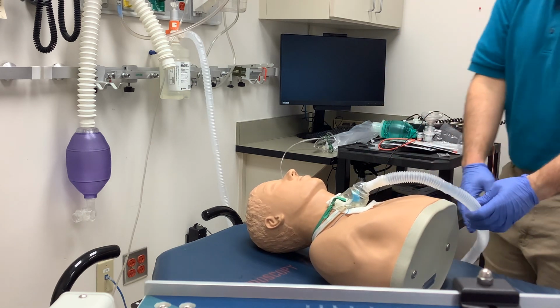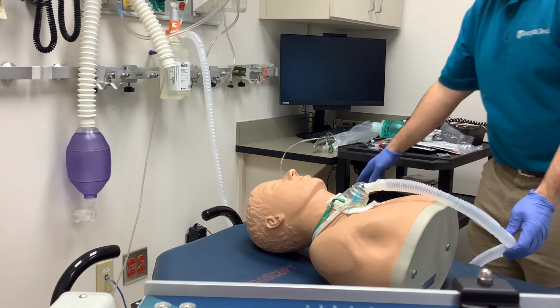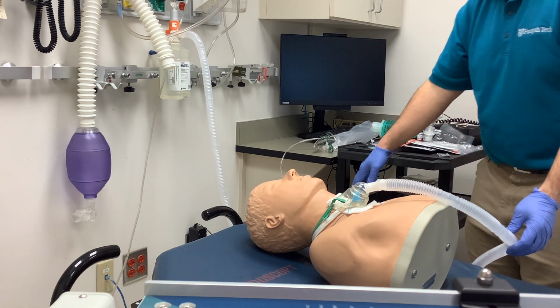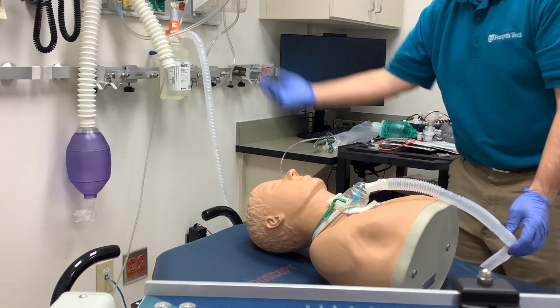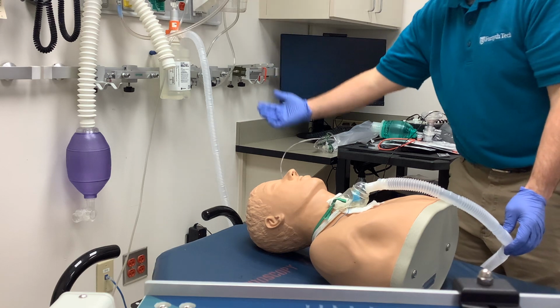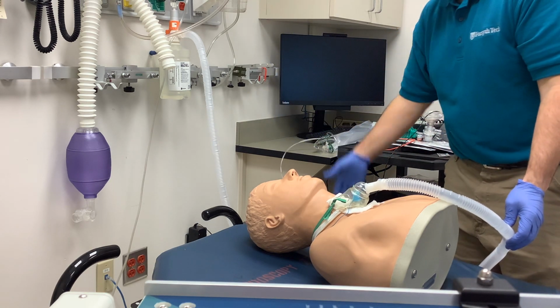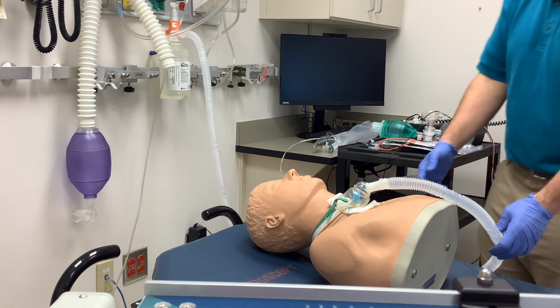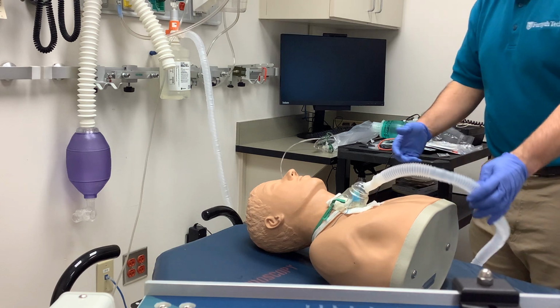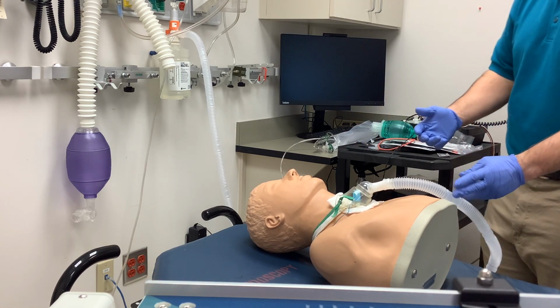And if you needed to, I'm just working with half a torso, but there's also a clip on this aerosol drainage bag. You can't see it in frame, but it's lying on the floor. You can clip it at the lowest point, so the condensation, the water as it rains out of the particulate water that's going to collect on the inside of that corrugated tubing, can drain down to the lowest point and collect in that aerosol drainage bag. So that would be about how you could go through and do your sterile open technique suction.